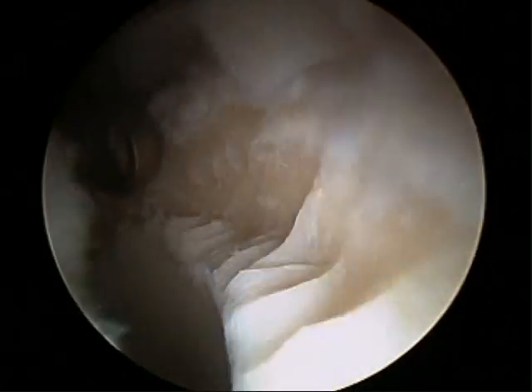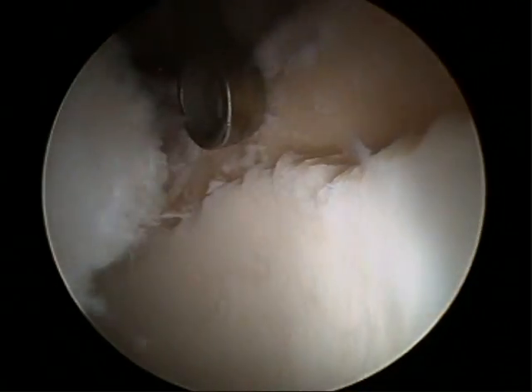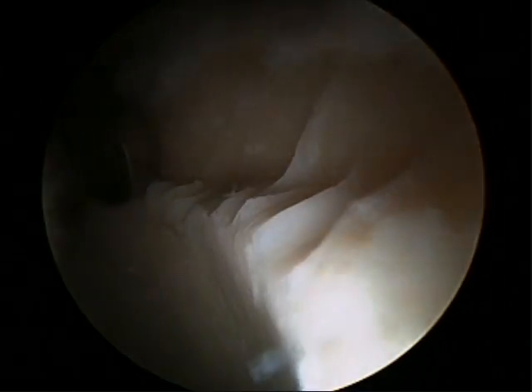So when we trim the rim back — this bony area here — it will be flush with the good cartilage down here.